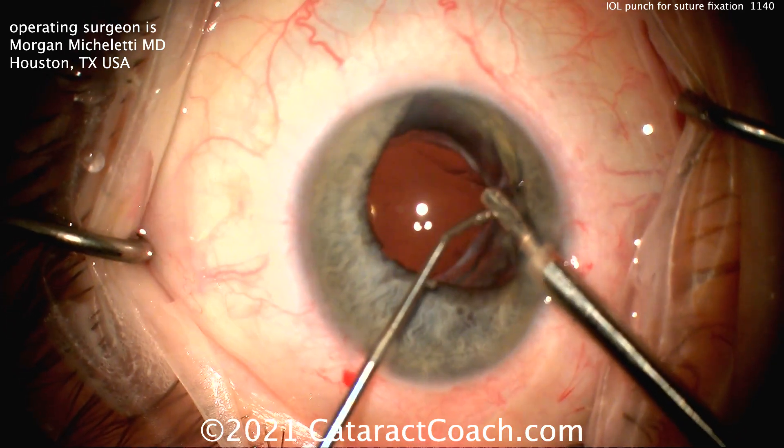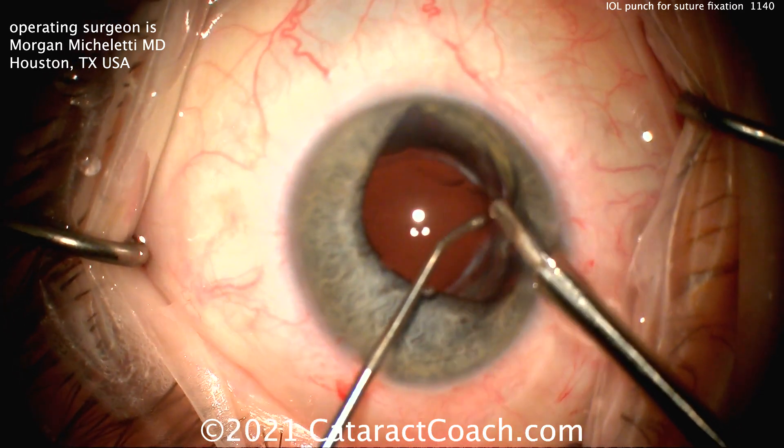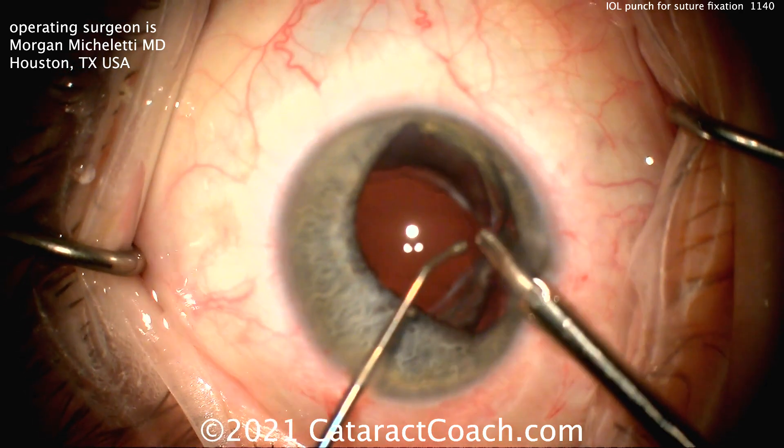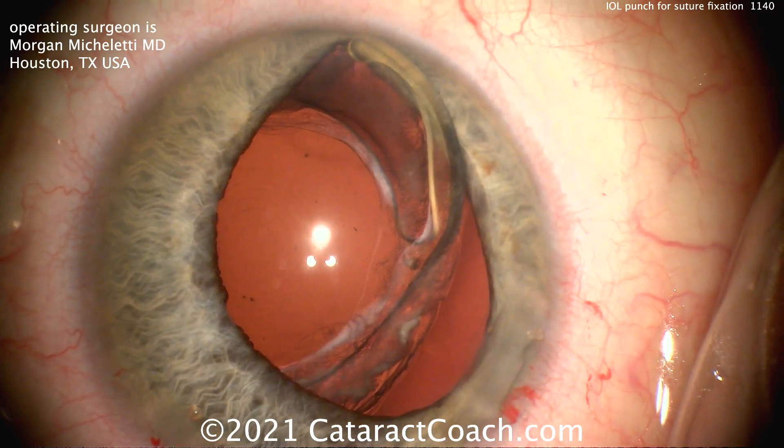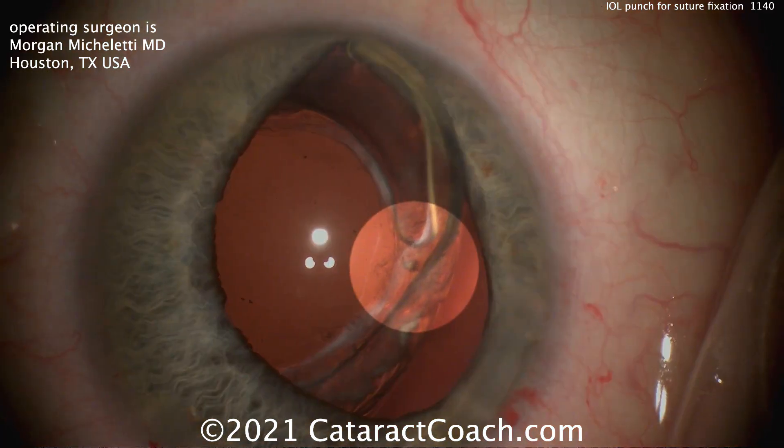This may be better than just poking a hole because you're actually removing a core of the acrylic lens material, resulting in a very nice, round, strong hole with no weak edges. That core can be pulled out of the eye, and there you can see the hole made right at the haptic-optic junction.